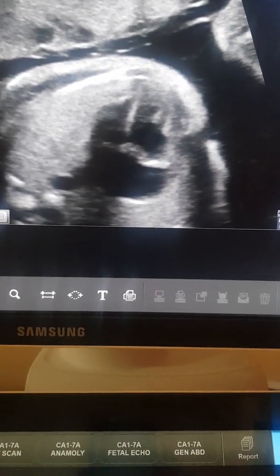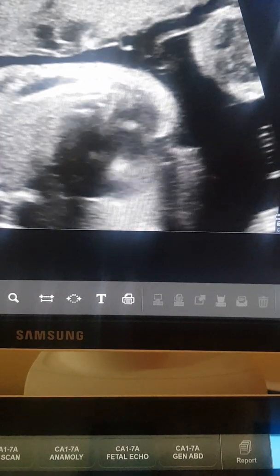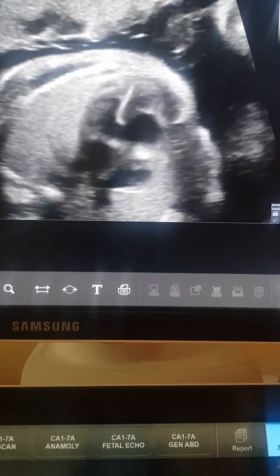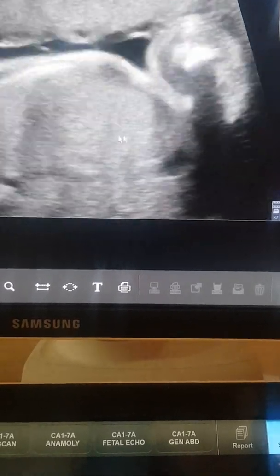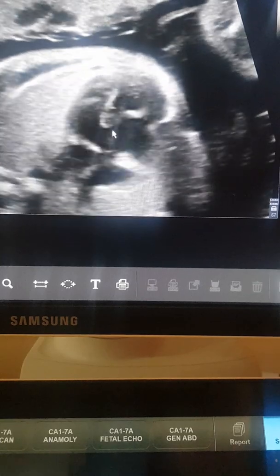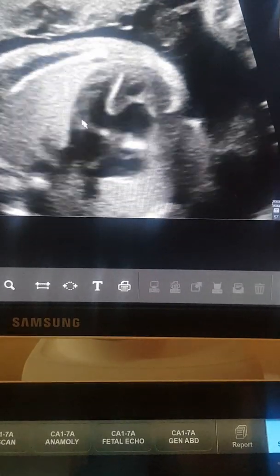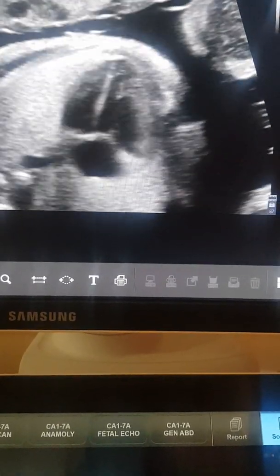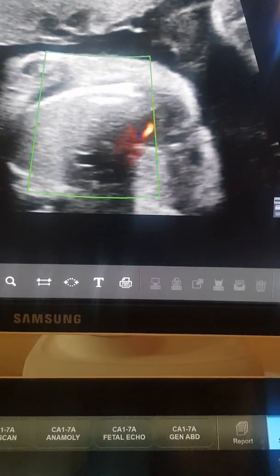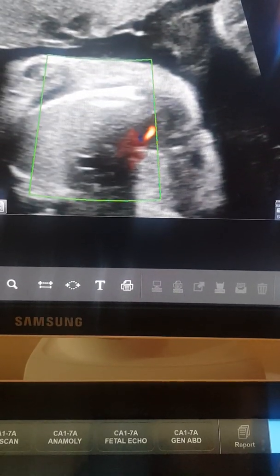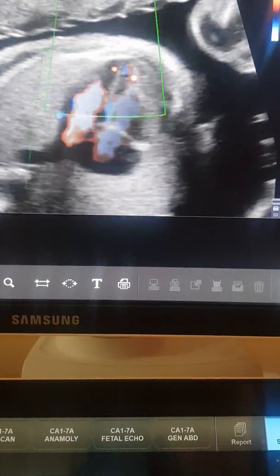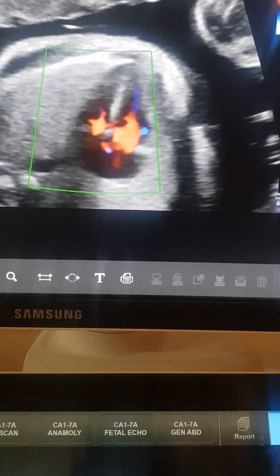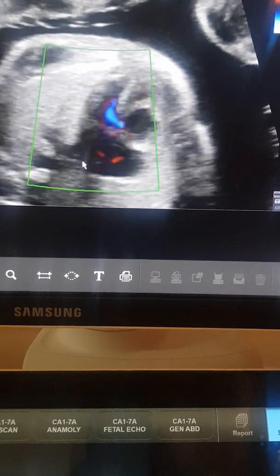I take another cine to look carefully at the crux of the heart, and I indeed realize that it is not a dropout artifact — there is a true ventricular septal defect as shown here.